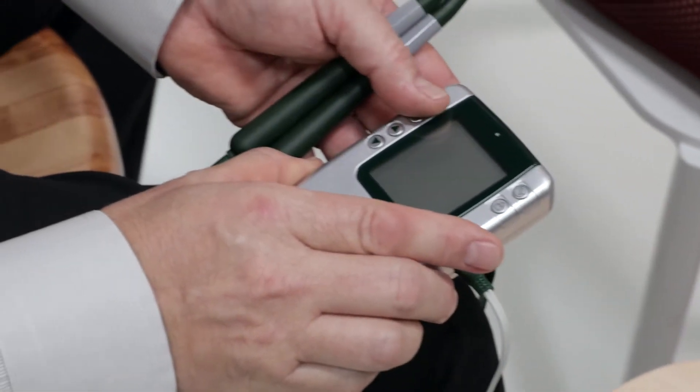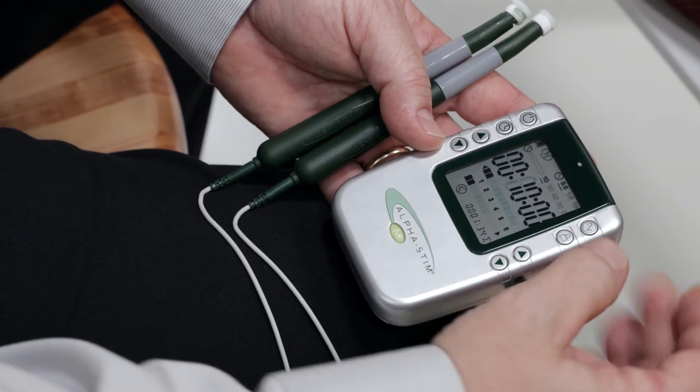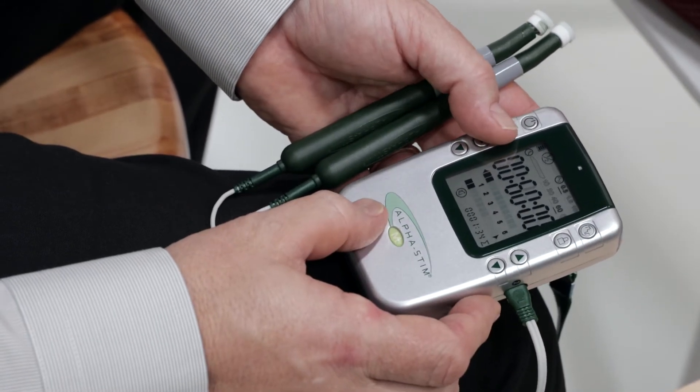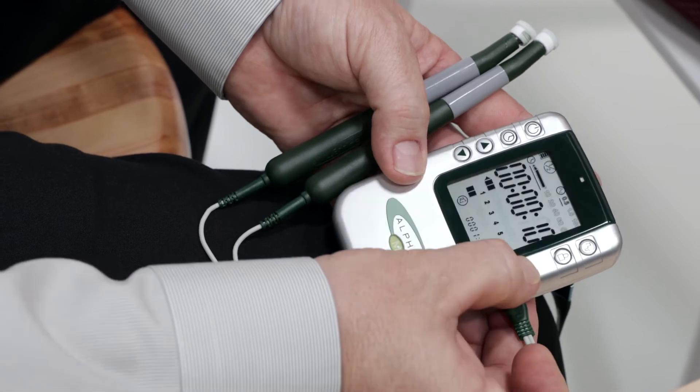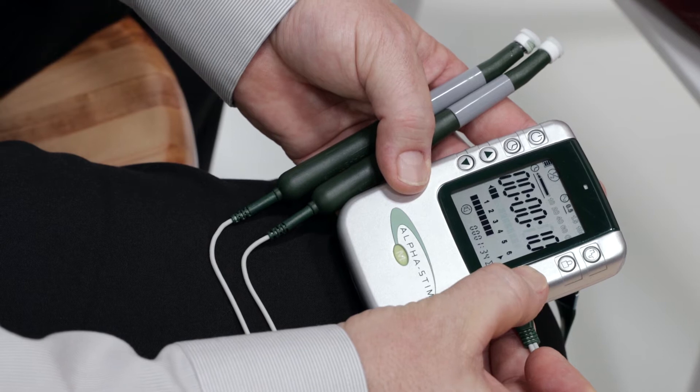Press power on. Set frequency to 0.5 hertz. Set timer to probe setting. Set current on the channel in use to 600 microamps. Decrease immediately if uncomfortable.